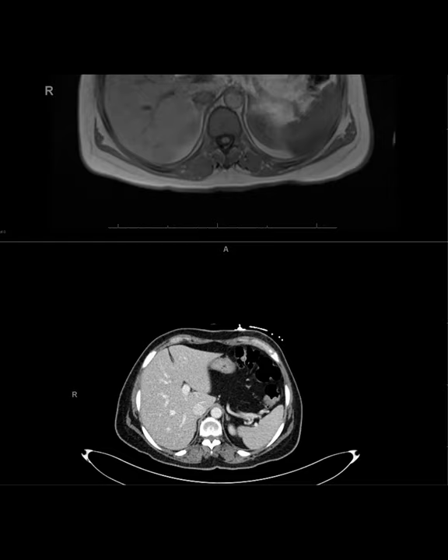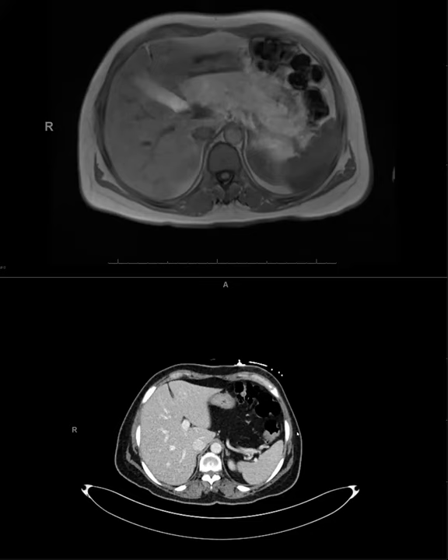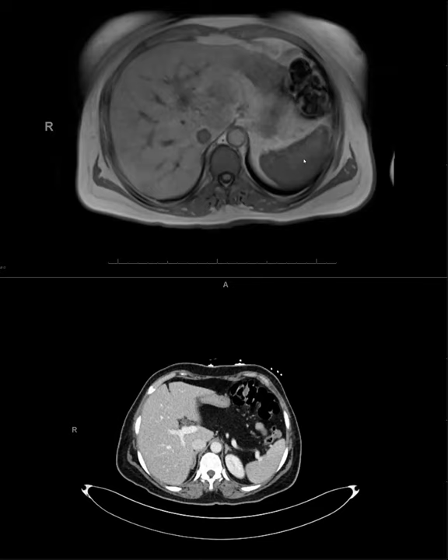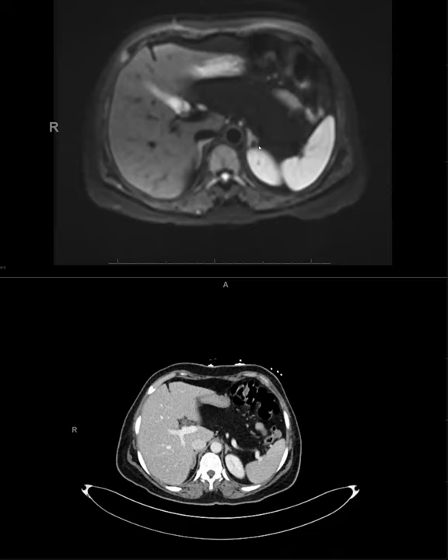Okay, so this is kind of like an imager's diagnosis, or an imager's differential. This patient was imaged 3 times. Earliest was about 6 or 7 months before the MRI, but it's basically showing the same finding. It's a 40-some-year-old female that presented to the GI service with lipomatosis. Yeah, but fatty replacement of the pancreas.